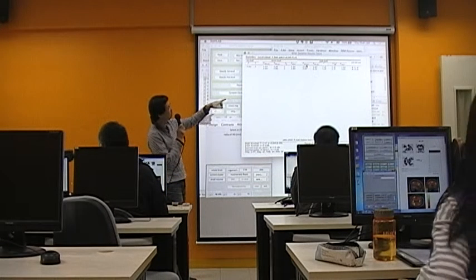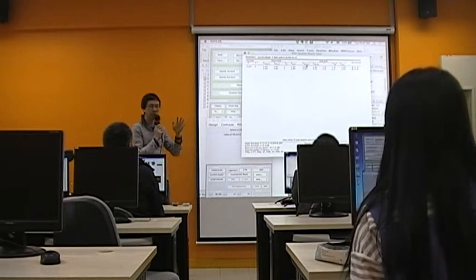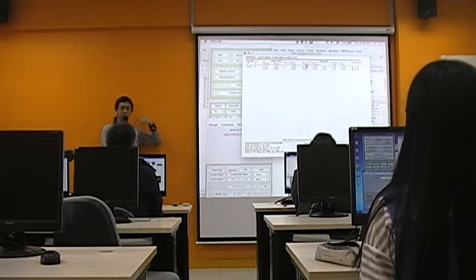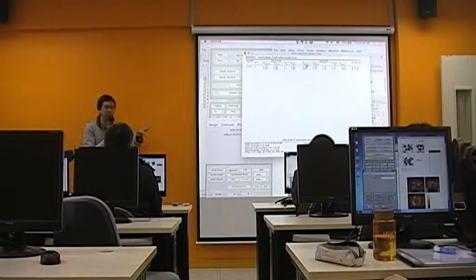And then you see the p-value. One is 0.01, which is really nice, and the other one is 0.05, which is marginal. Perhaps you could still use that, but at least you have one peak. So you could report this and then use it for replication. Now this is one way to circumvent the problem.